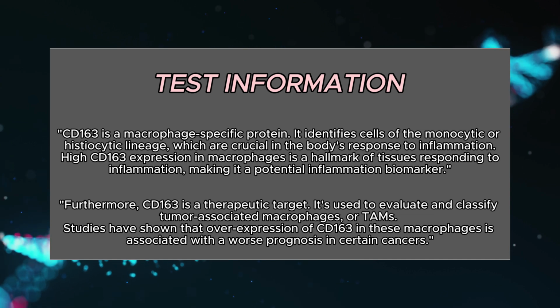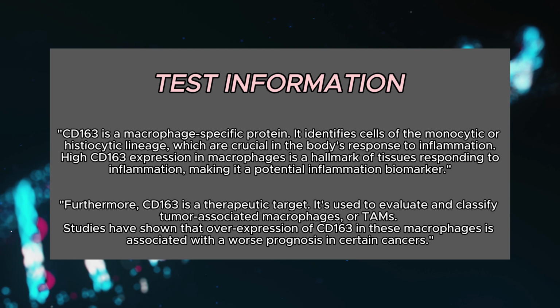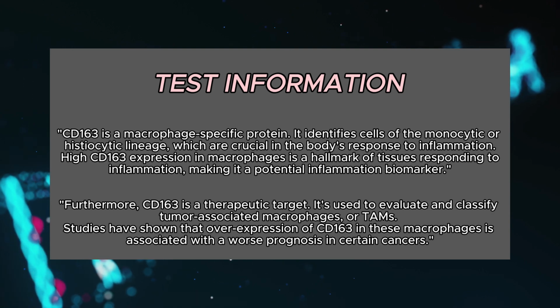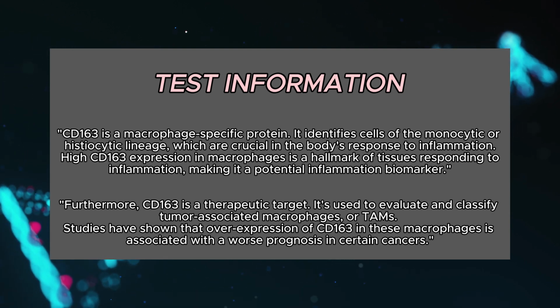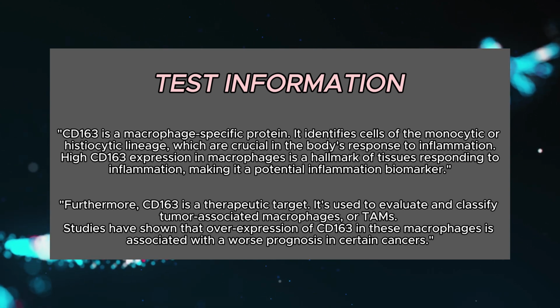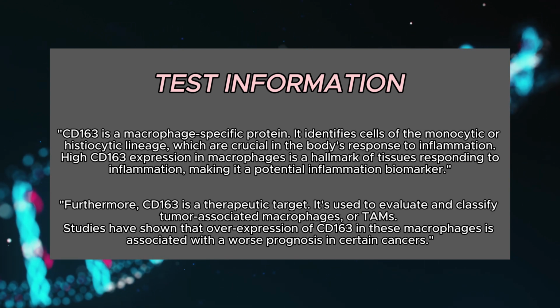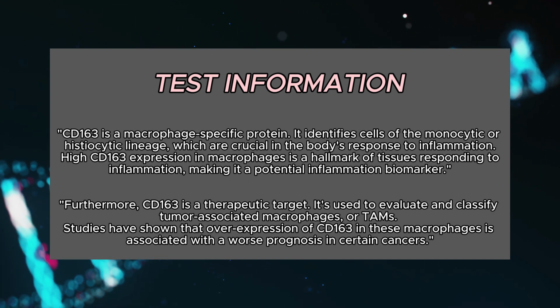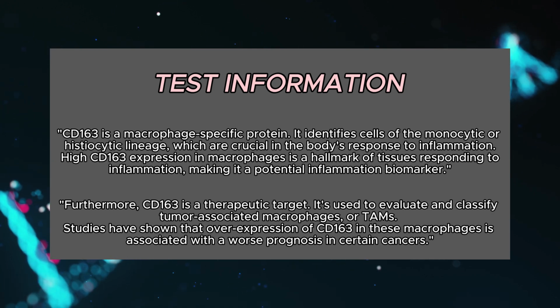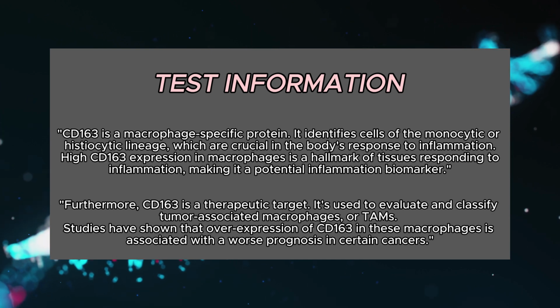Test information. Let's delve a bit deeper into the significance of CD163. CD163 is a macrophage-specific protein. It identifies cells of the monocytic or histiocytic lineage, which are crucial in the body's response to inflammation. High CD163 expression in macrophages is a hallmark of tissues responding to inflammation, making it a potential inflammation biomarker.